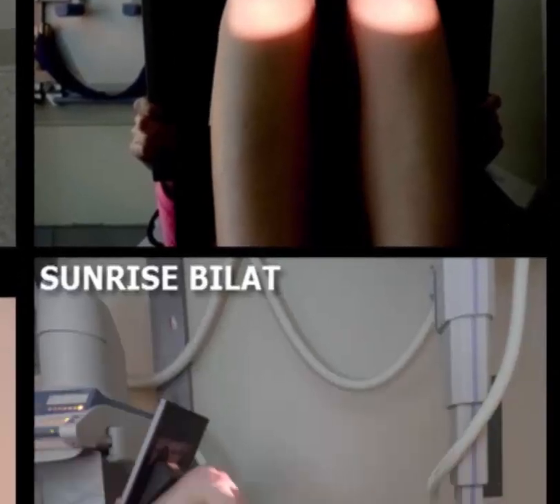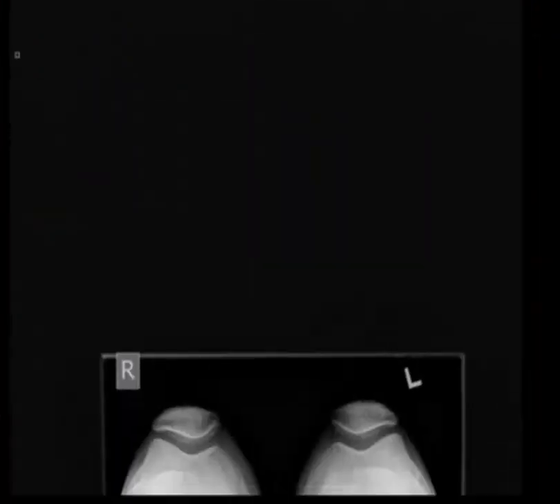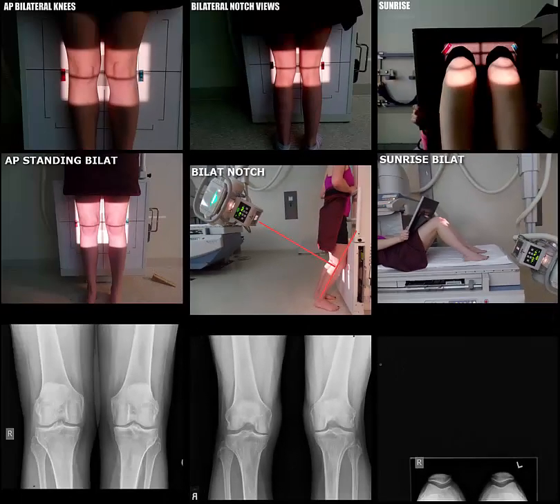The following image should be produced. Now you have completed additional views, both AP standing, bilateral notch, and sunrise as well.